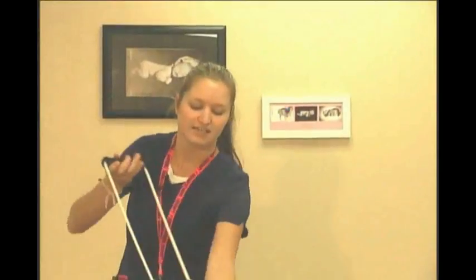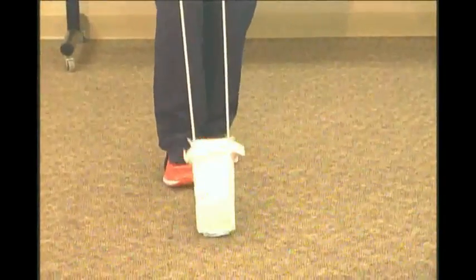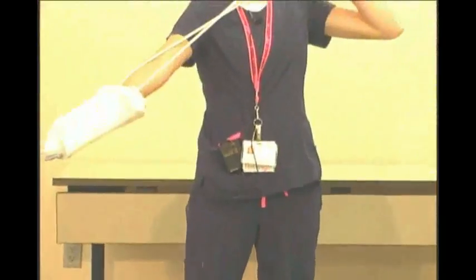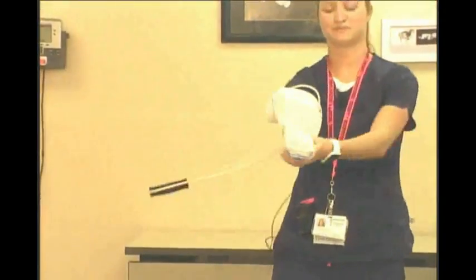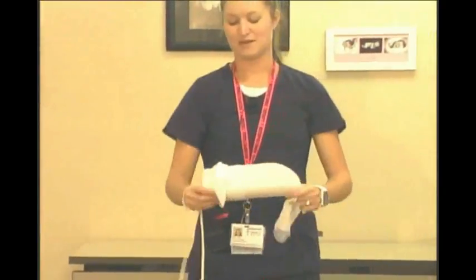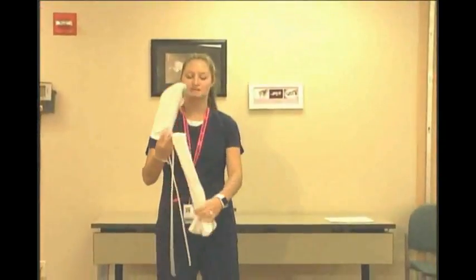You're going to cast this out in front of you onto the floor, and then you'll slip your foot inside like so. So in order to get a good demonstration of what that looks like, if my hand is my foot, I'll pull it on like so. Some days, of course, it will work better than others. It may go up all the way as high as you want it to, and other days it may just barely make it past your heel.